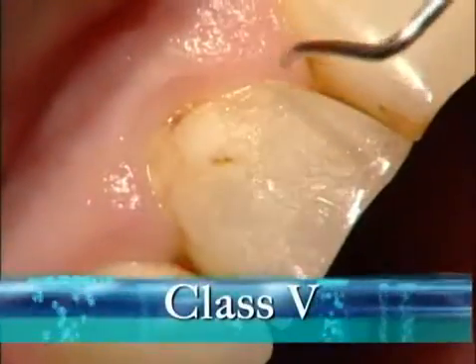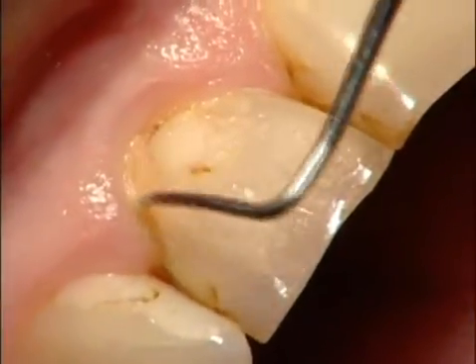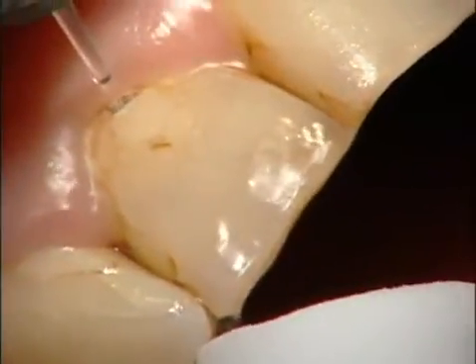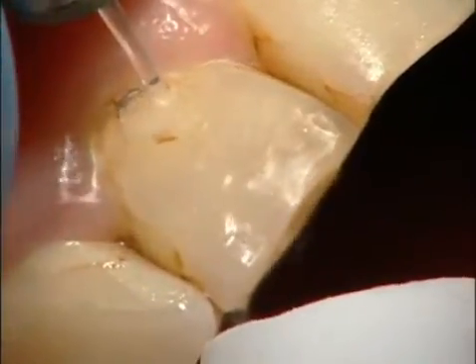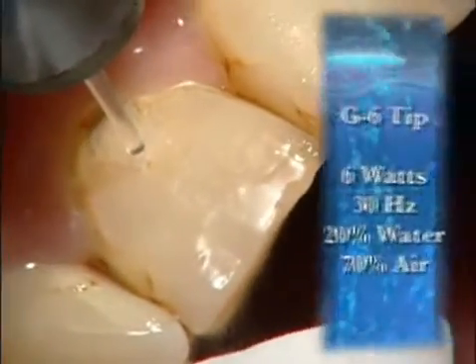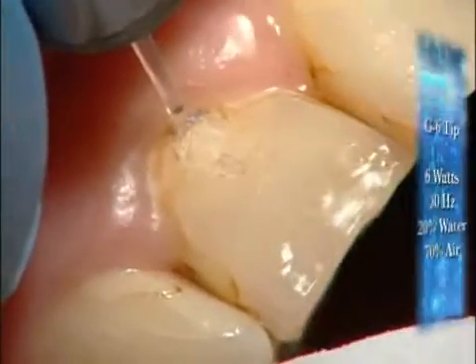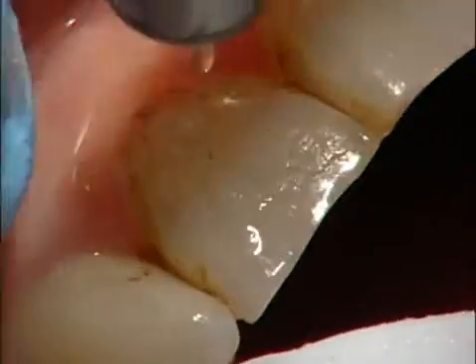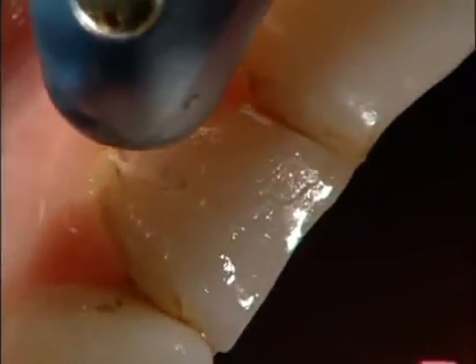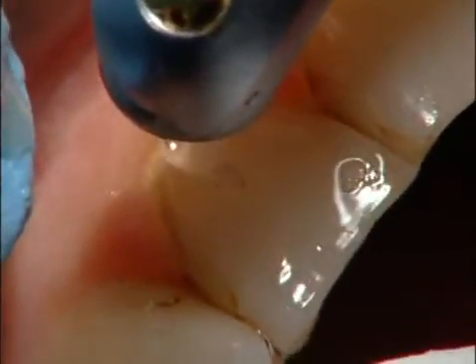So oftentimes I'm asked, how easily does the laser remove old composite? So here we have a patient with a class 5 composite with recurrent decay. After my laser anesthetic, I'm going to start removing the composite. This is a G6 tip at 6 watts, 30 hertz, 20% water. You can vary your water between 20 and 50. I really like that 20% water and 70% air. You can see that the laser is rapidly removing the old composite.